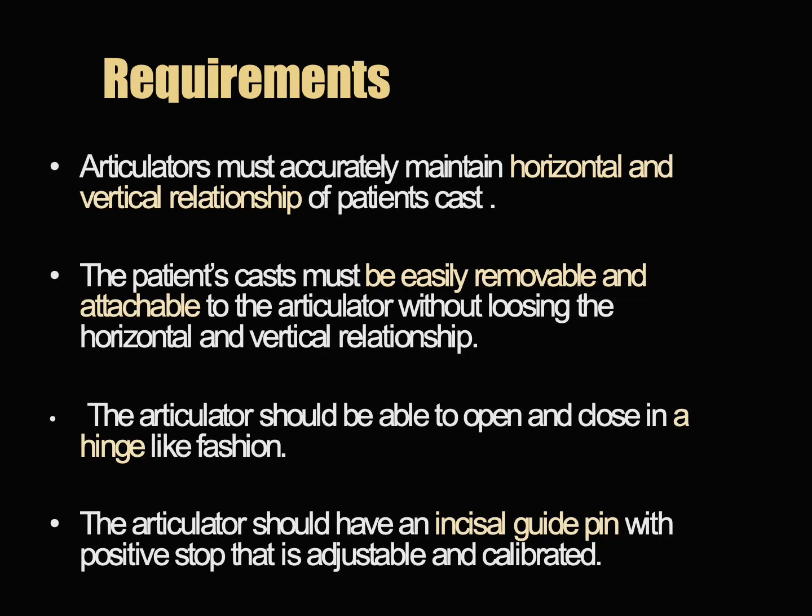The requirements. The articulator must accurately maintain the horizontal and vertical relationship of the patient's cast. The patient's cast must be easily removable and attachable to the articulator without losing the horizontal and vertical relationship. The articulator should be able to open and close in a hinge-like fashion.